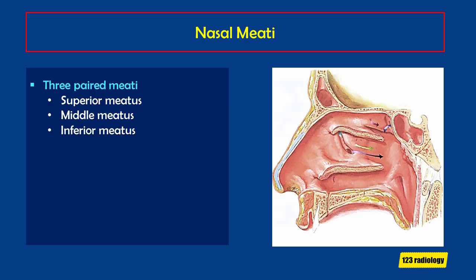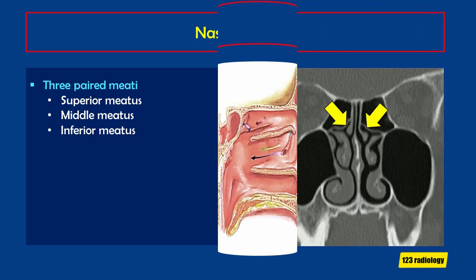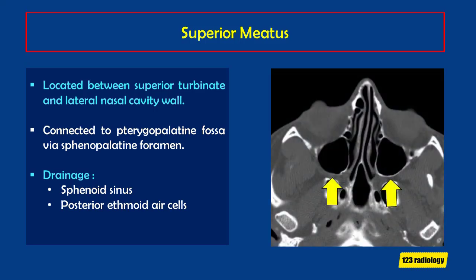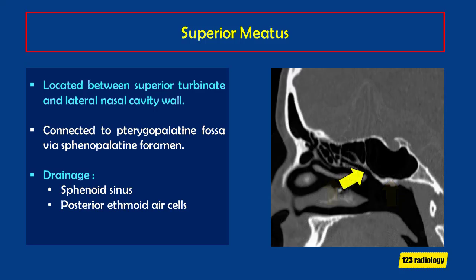The inferior meatus receives drainage from the nasolacrimal duct. The superior meatus is located between the superior turbinate and lateral nasal cavity wall, and it is connected with the pterygopalatine fossa through the sphenopalatine foramen. It receives drainage from the sphenoid sinuses and posterior ethmoid air cells, as can be seen on this sagittal cut.